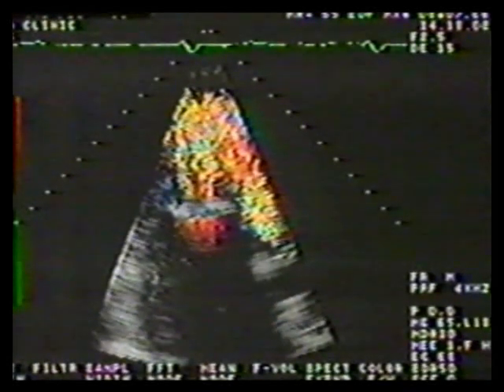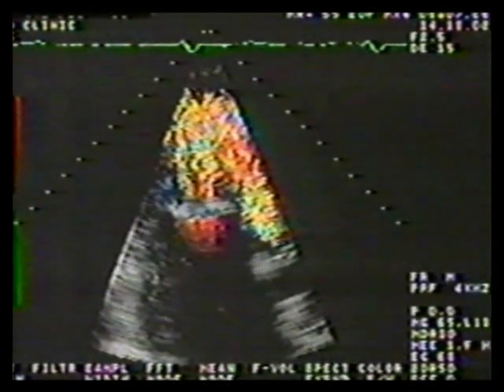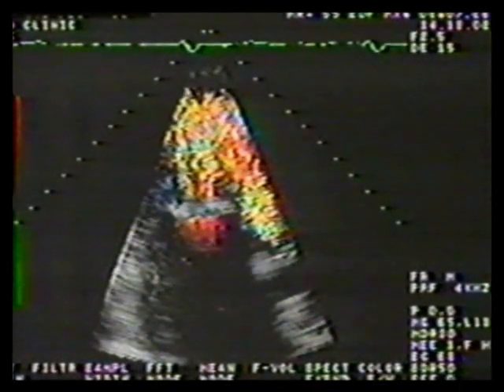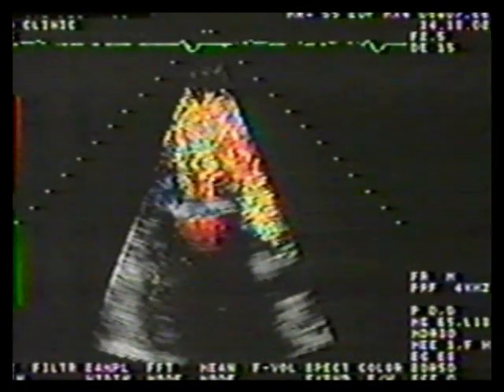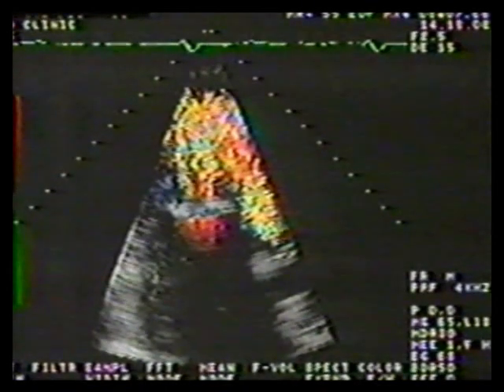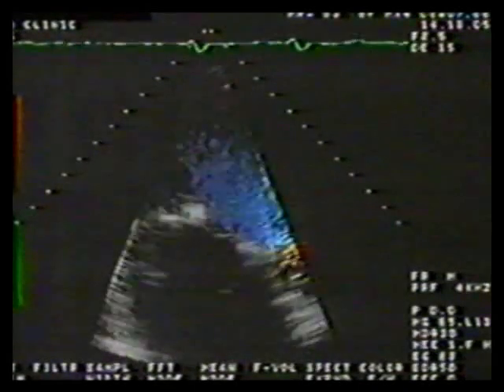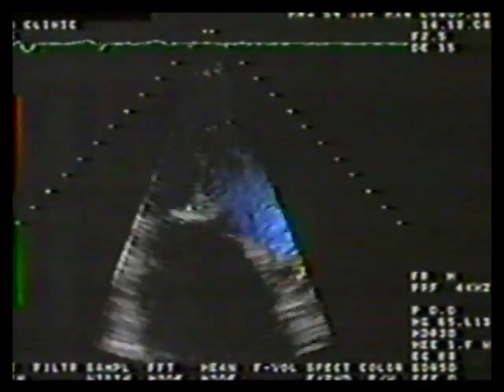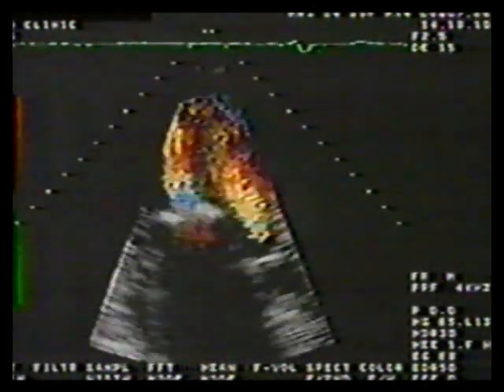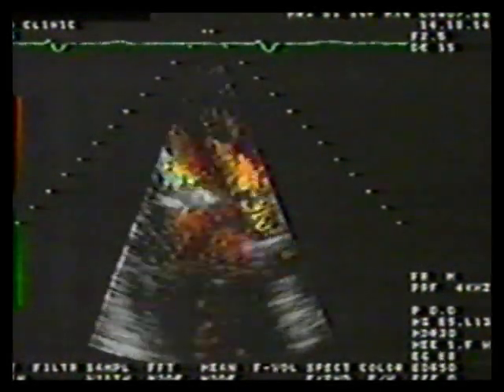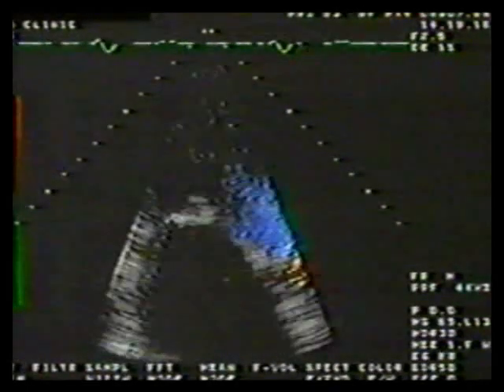This tape has demonstrated the utility of echocardiography in delineating mitral pathology and assessing its functional significance. Structural abnormalities are clearly defined by two-dimensional echo, while valuable hemodynamic information is added by Doppler and flow imaging. This same combination of structural and functional information is also invaluable in the diagnosis of aortic valve disease, the subject of tape number four.